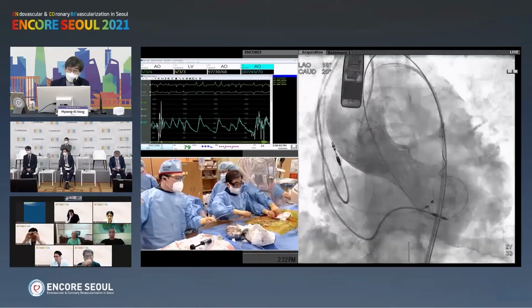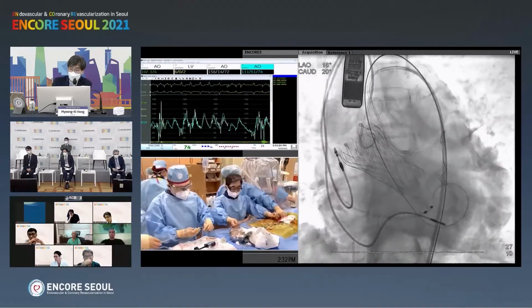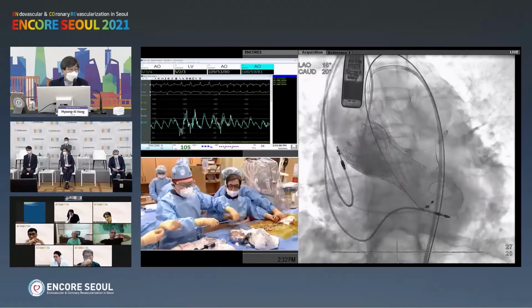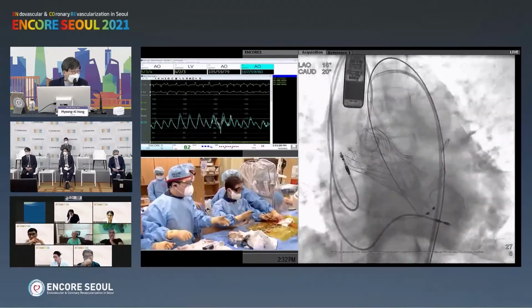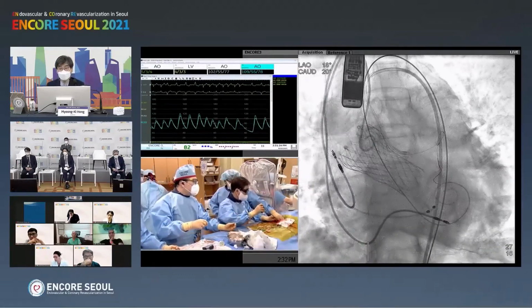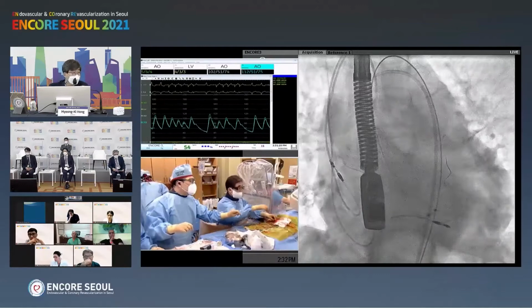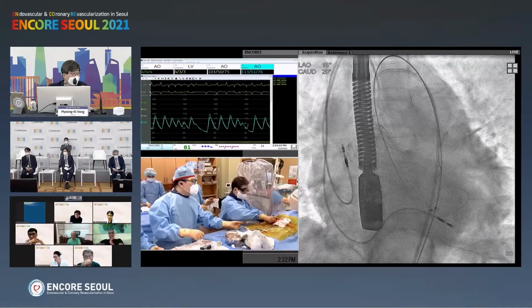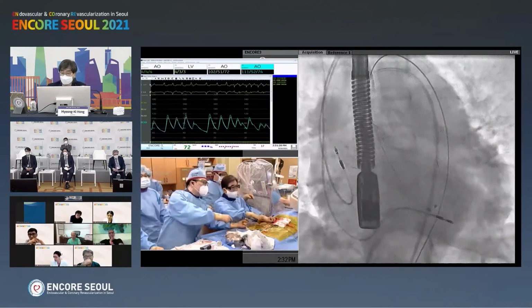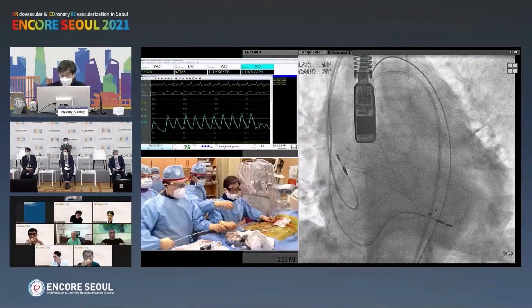So, how do we fix it? This kind of patient, Professor Kim shows that the use of the self-expandable valve gives the operator a very comfortable feeling during the procedure. 좀 22면 돼요? 준비해 주세요. 네, 준비해 주세요. We can clearly see the space between the coronary ostium and the valve. Why stay? Okay. 자, 픽테일.